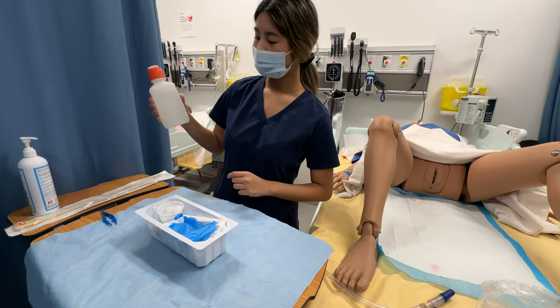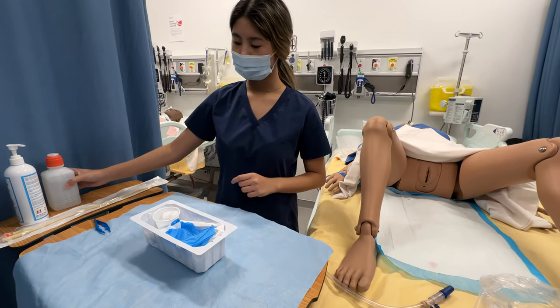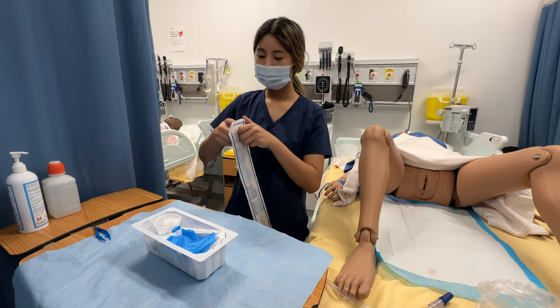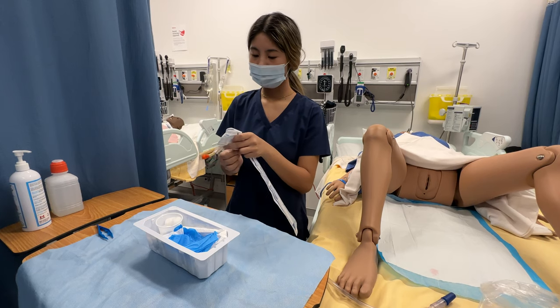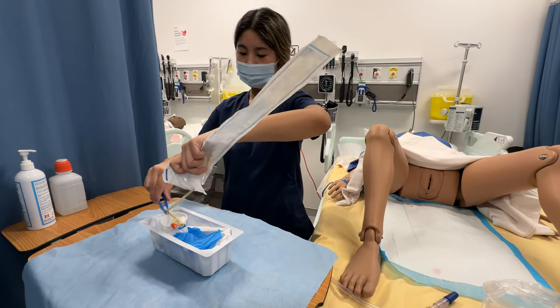With my newly opened bottle, I'm going to insert it into the tray. I'm not going to lift the lid because it's new. I'm going to open my catheter banana peel sterile packaging, and I'm putting it in my sterile field.